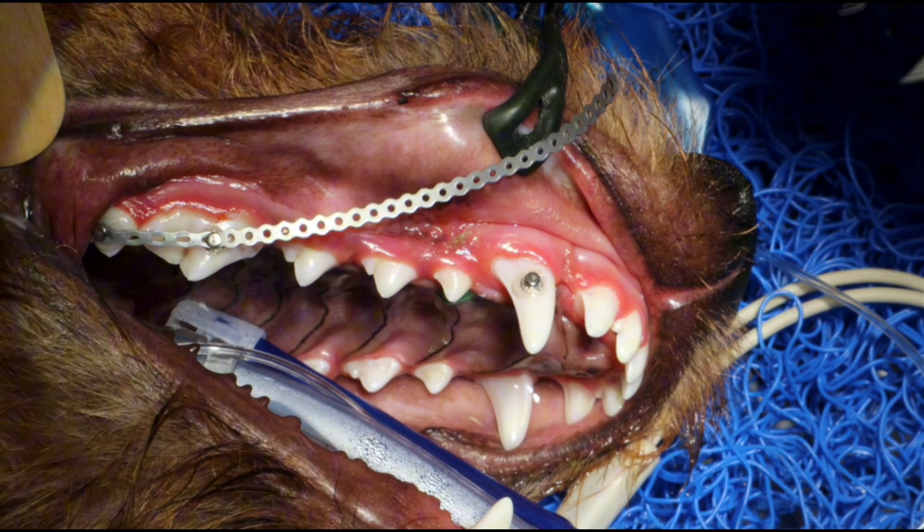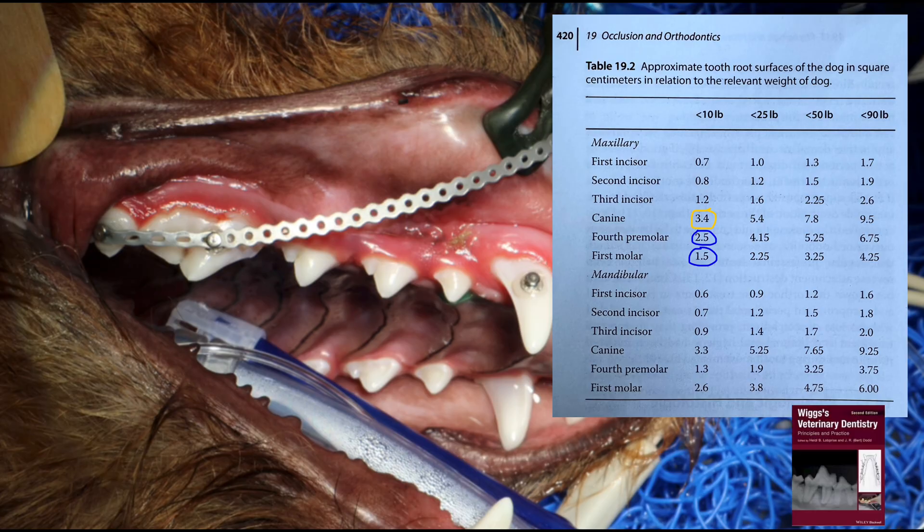One way to avoid moving the wrong teeth is to look at tooth root surfaces. From Wicks Veterinary Dentistry: the canine tooth root surface is 3.4 and the 4th premolar is 2.5. So if you only secured it to the 4th premolar, it would be the 4th premolar moving distally, not the canine moving back. That's why we include the first molar, which brings the surface up to 4 — greater than the canine.